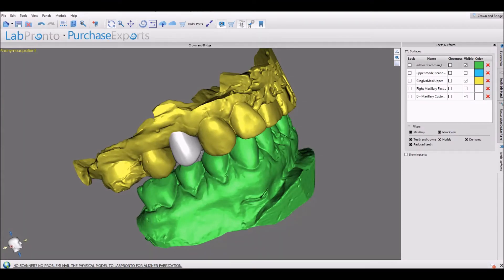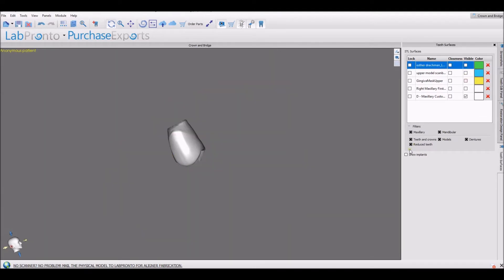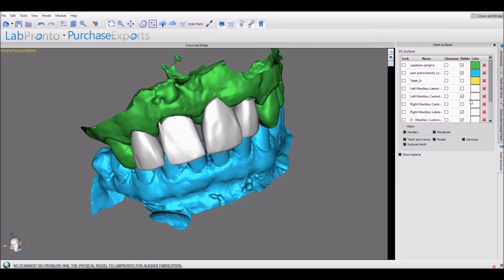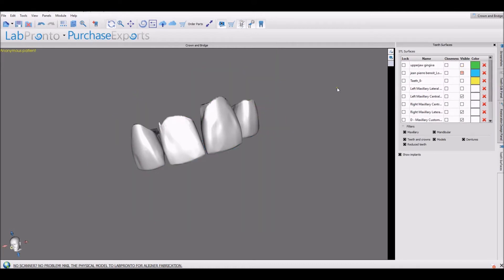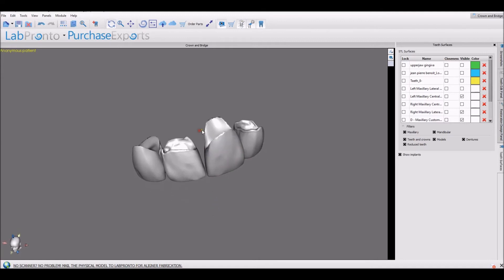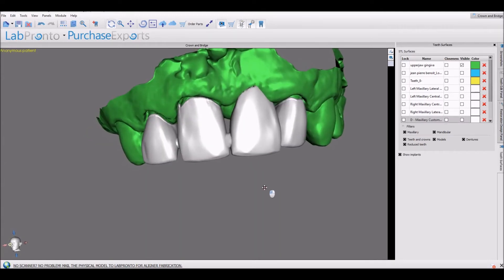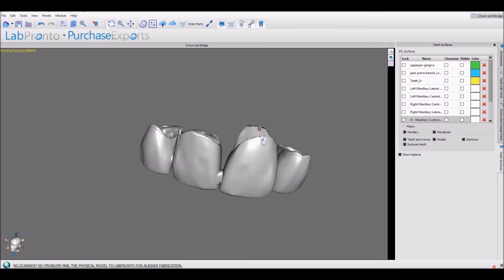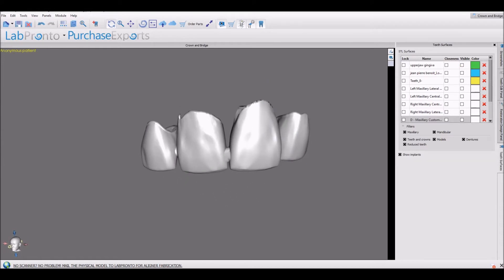The new version of Blue Sky Plan allows the creation of crowns and bridges. You can create a crown for a titanium based abutment, conventional crowns, and bridges. Crown and bridges can be exported from the crown and bridge module at no cost.